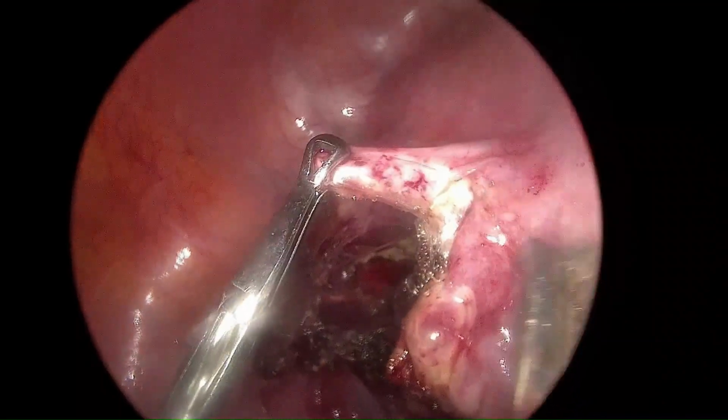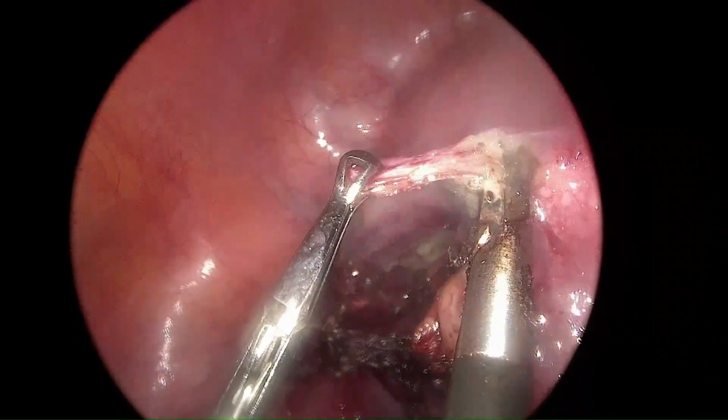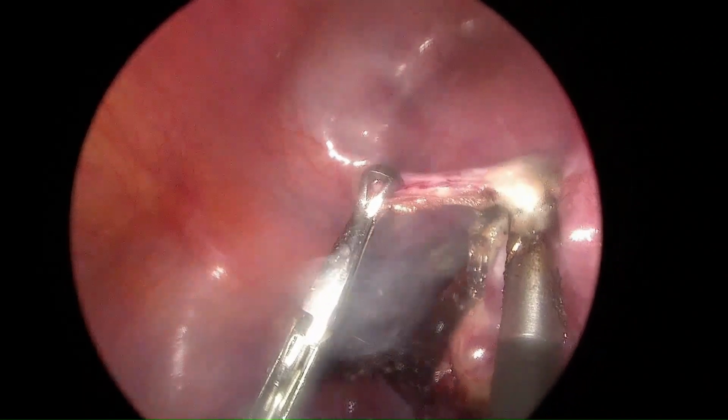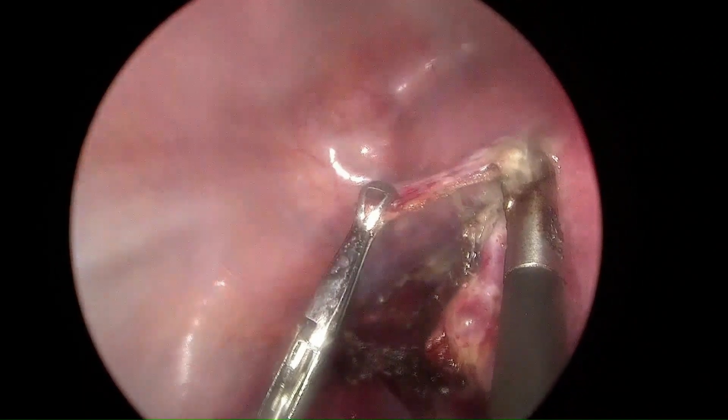First step is to recognize the medial umbilical ligament. Bladder never extends beyond the medial umbilical ligament. So we can cut the peritoneum boldly till about the medial umbilical ligament.